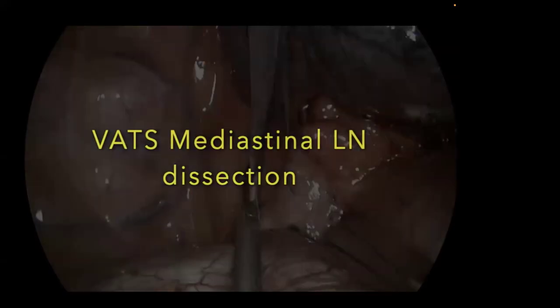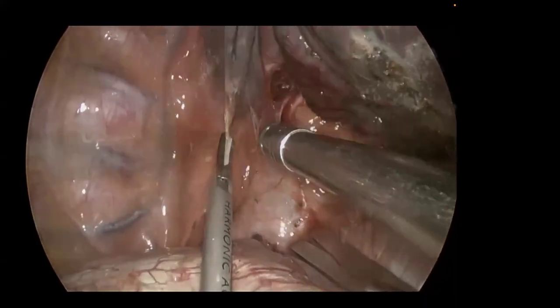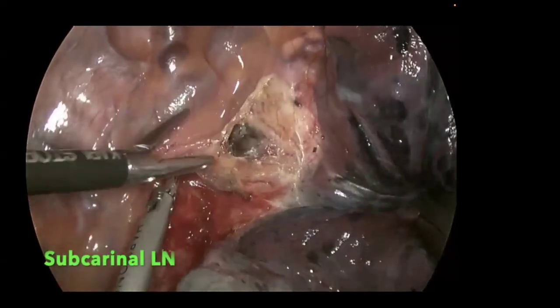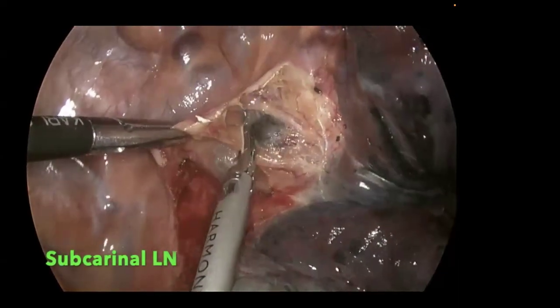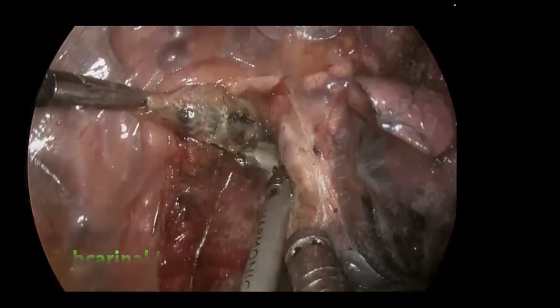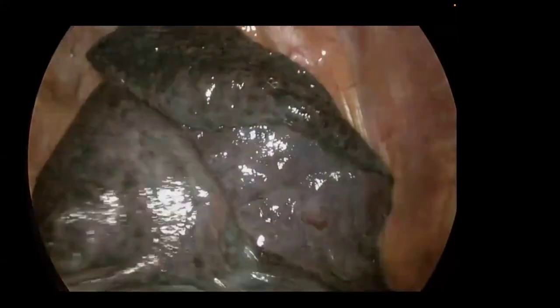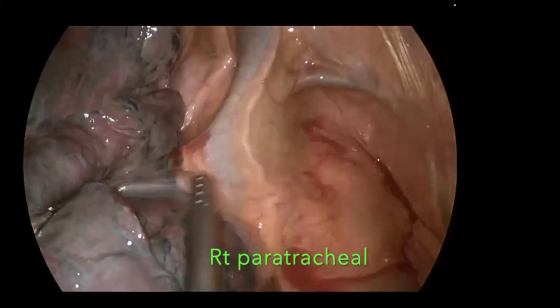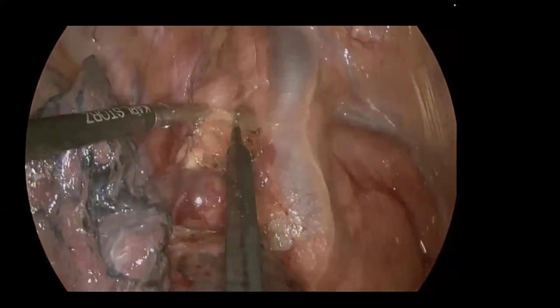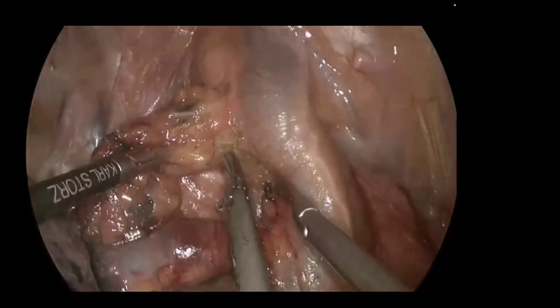As you can see in the robotic video also, by VATS we can address all the mediastinal lymph nodes, the ipsilateral lymph nodes actually. This is a subcarinal lymph node. The tissue is not going to be an issue if we do the biopsy by surgery. We can remove the whole lymph node packet and give it to the pathologist, who can give the answer for the reason for mediastinal lymphadenopathy. Now the paratracheal lymph node resection.